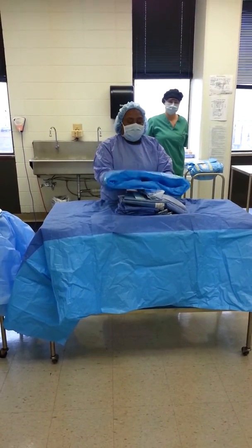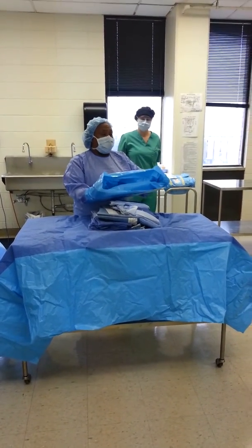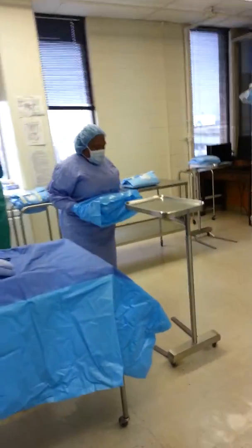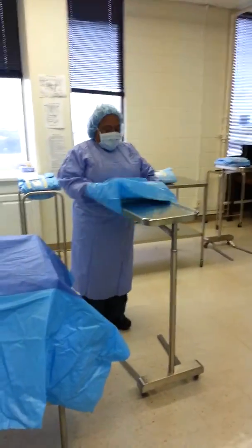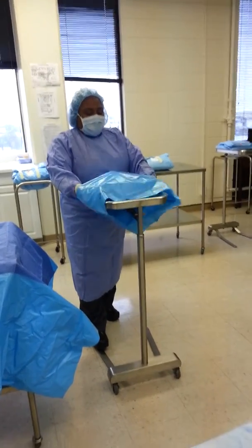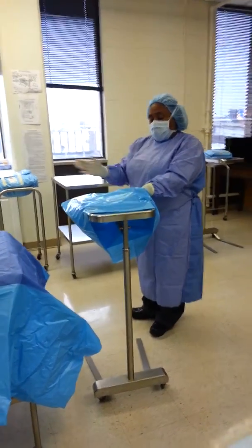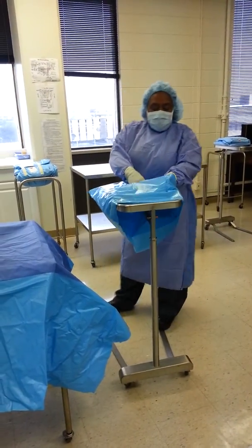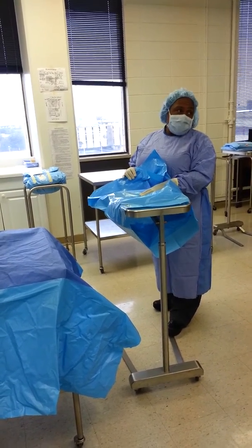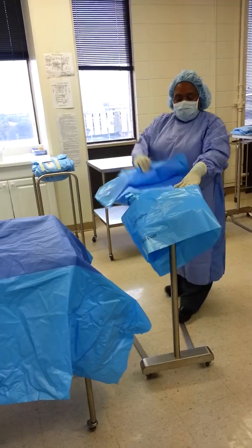So I'm tucked underneath. Y'all can see my opening. Yeah. So now I can't bend and try to look because I don't know if my mask's gonna touch. Okay, so I'm just going with what I know. I proceed to slide it on. I step on the thing so it don't roll all over the place. So then I go as far as I can. It stops. I step to the outside and I can put it on, or I can stand in front. I step to the outside because this comes up high and I'm short, so it may touch my mask and I don't know. But if I'm to the outside, it's over here, and all I'm doing is sliding it on.